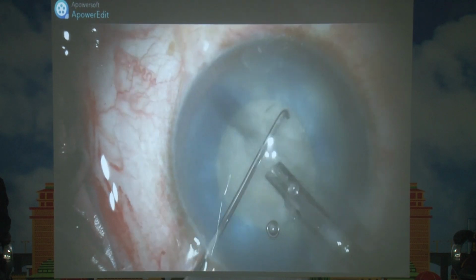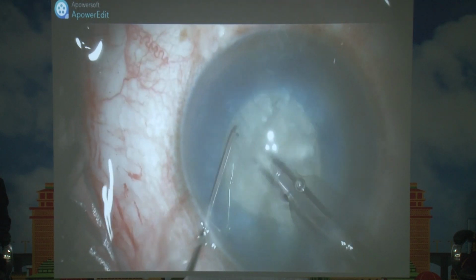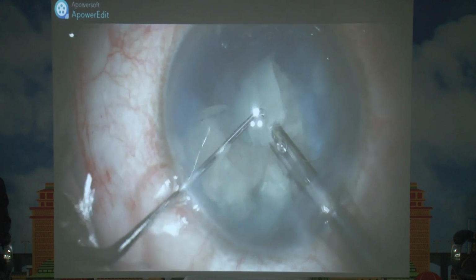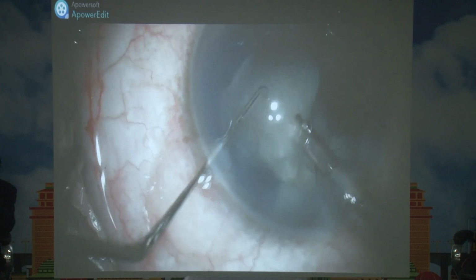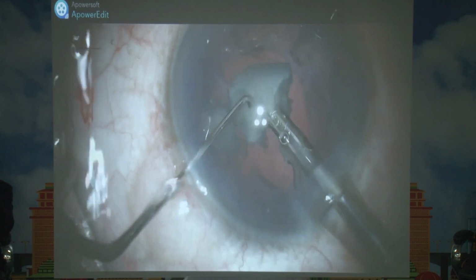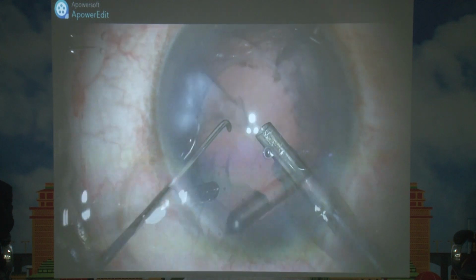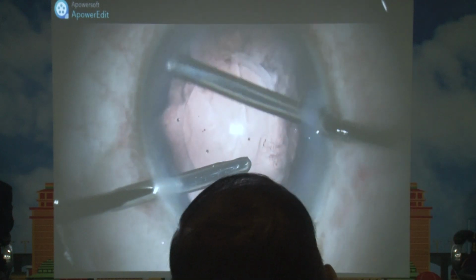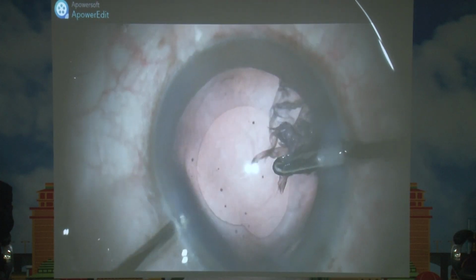Most importantly, you need to have very good anterior chamber stability and flatten the anterior capsule with viscoelastic, high molecular weight viscoelastic, whenever you do a capsular rhexis in these cases. I usually do not prefer to do it through the main incision, otherwise you can open up the incision, the viscoelastic will come out, there is shallowing, and that can cause more risk of the anterior capsular tear. So the rest of the steps are the same.